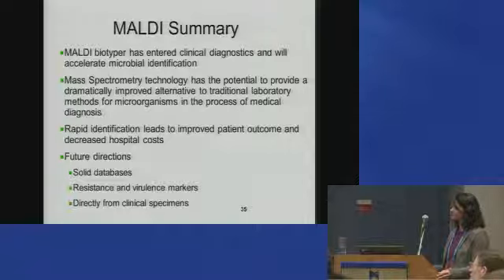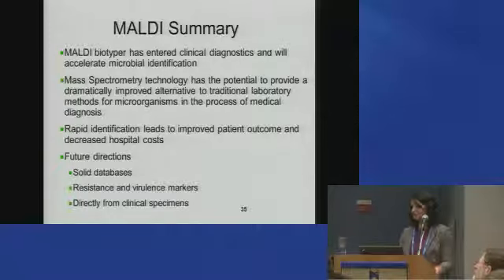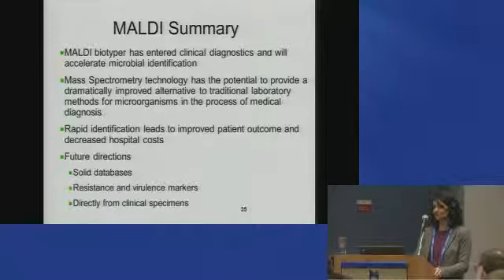And then looking at resistance and virulence markers is something that's being worked on. And then directly from clinical specimens, that's an area which right now needs to be worked on.